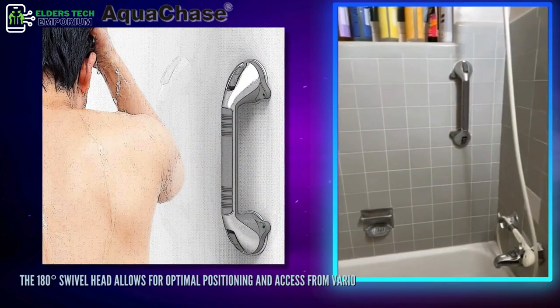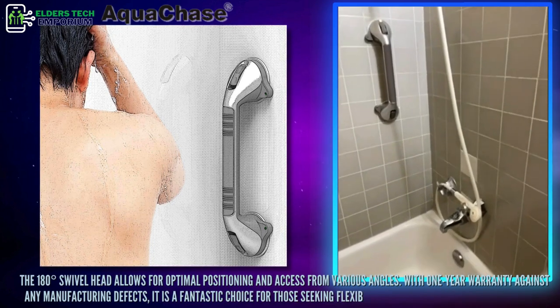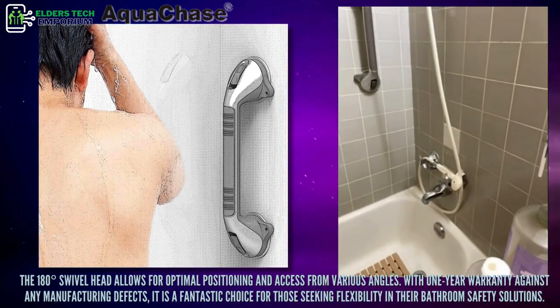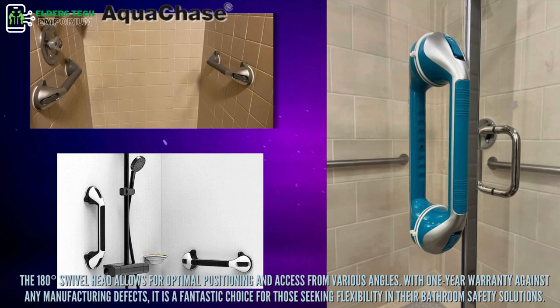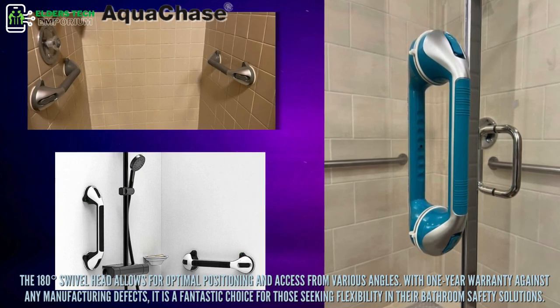The 180-degree swivel head allows for optimal positioning and access from various angles. With a one-year warranty against any manufacturing defects, it is a fantastic choice for those seeking flexibility in their bathroom safety solutions.